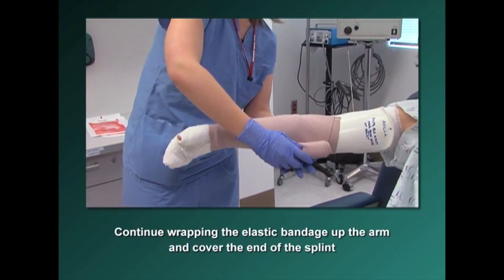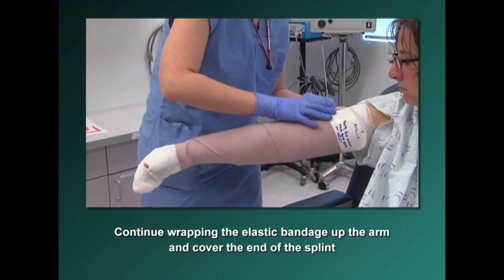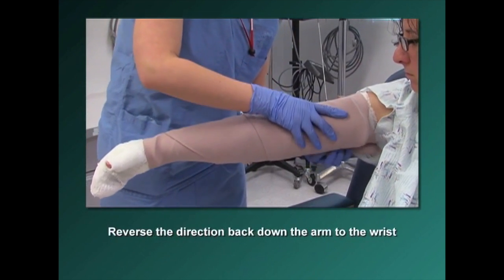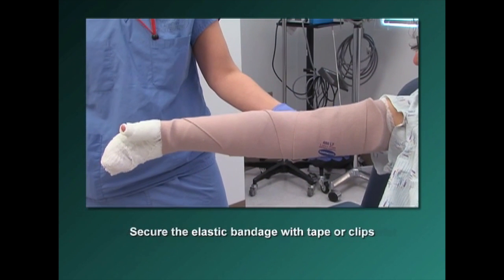Cover the distal end of the splint with the elastic bandage. Continue wrapping the elastic bandage up the arm and cover the end of the splint. Then reverse the direction back down the arm to the wrist. Secure the elastic bandage with tape or clips.